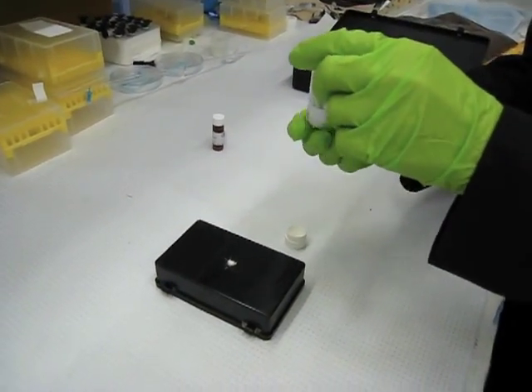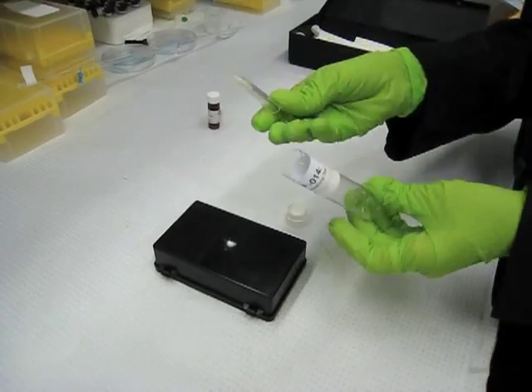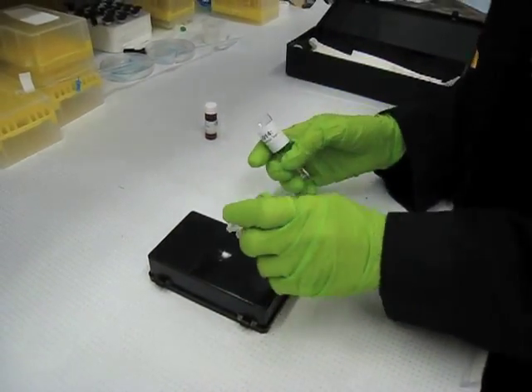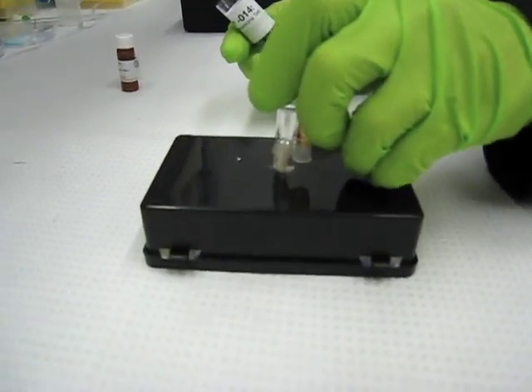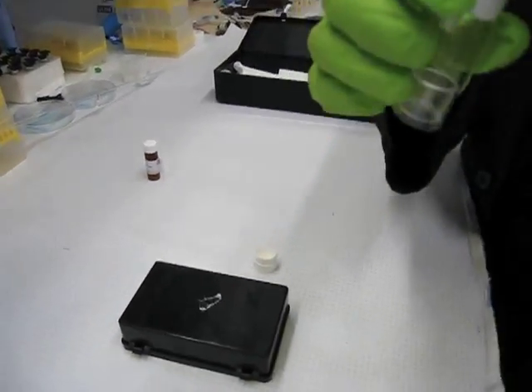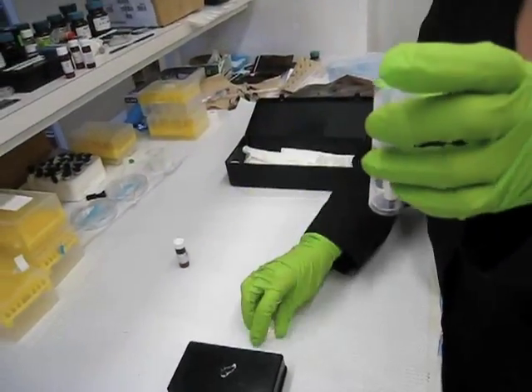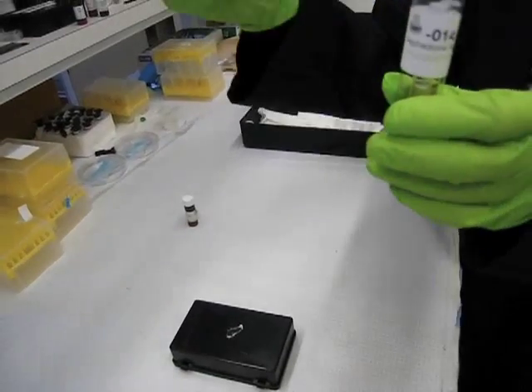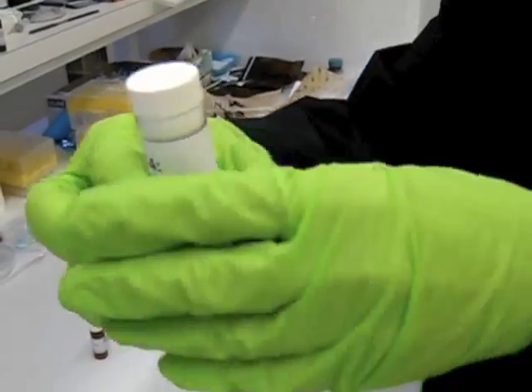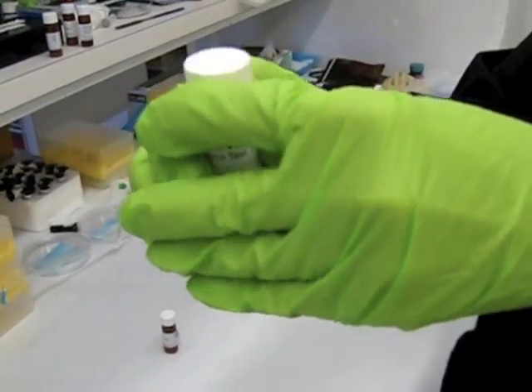Remove the sampler from the clear outer tube. Careful not to touch the sticky sampler tip. Dab the tip on the material to be tested, and replace the sampler in the clear outer tube, tip first. Replace the cap of the clear outer tube. Squeeze the clear outer tube and the sampler to break both the ampules in the sampler.